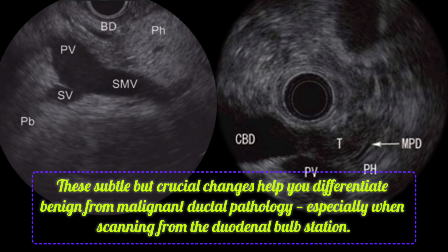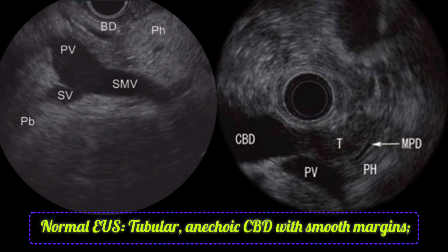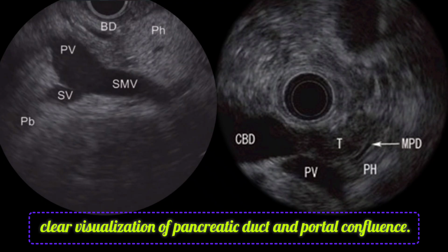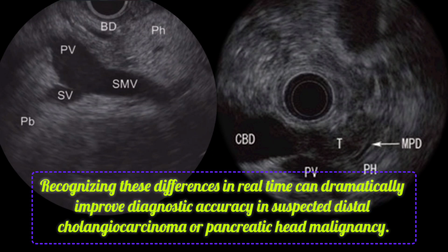These subtle but crucial changes help you differentiate benign from malignant ductal pathology, especially when scanning from the duodenal bulb station. Let us summarize. Normal EUS, tubular anechoic CBD with smooth margins, clear visualization of pancreatic duct and portal confluence. Abnormal EUS, hypoechoic heterogeneous mass with irregular borders invading the pancreas. Recognizing these differences in real time can dramatically improve diagnostic accuracy in suspected distal cholangiocarcinoma or pancreatic head malignancy.